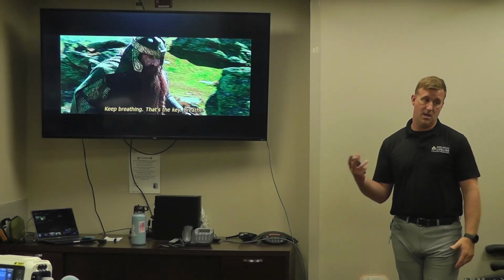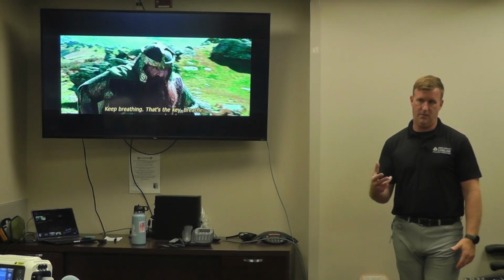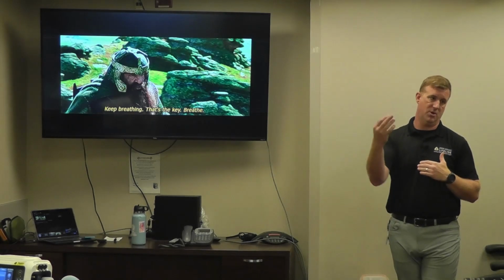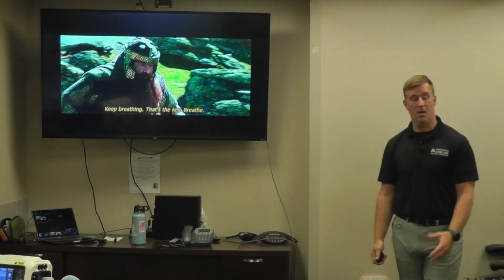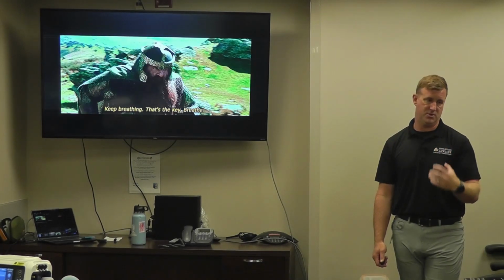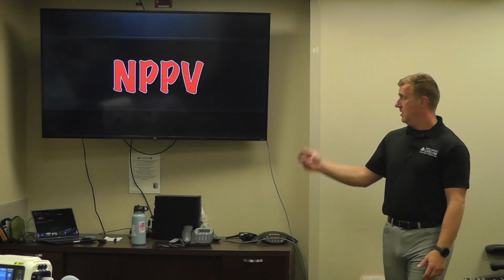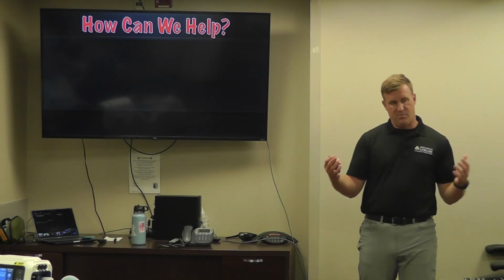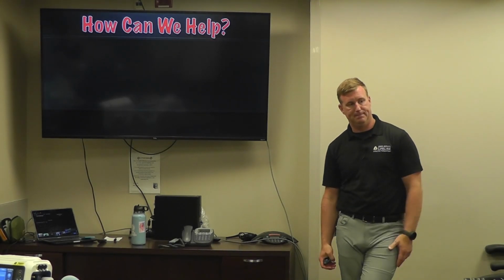Most of the time in hospital, or for the critical care transport teams, we use what's called BiPAP, which is essentially CPAP plus an additional pressure. Okay, and we'll talk through that in a second. But you're 100% right, that's non-invasive positive pressure. So some sort of positive pressure with a mask. All right, so what is non-invasive positive pressure? What is CPAP?